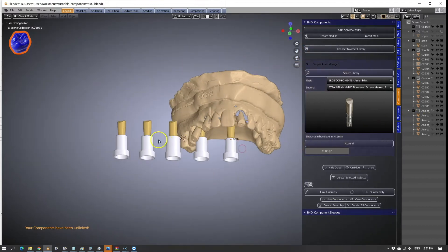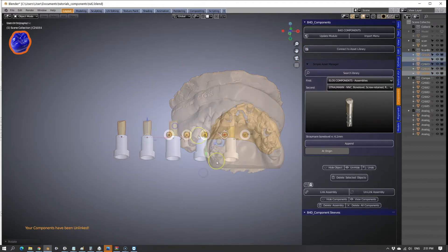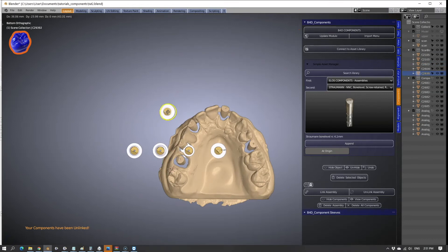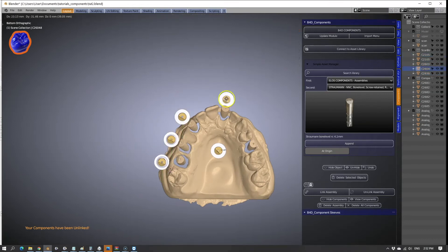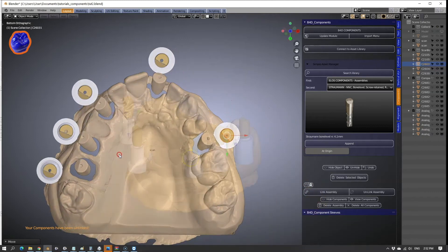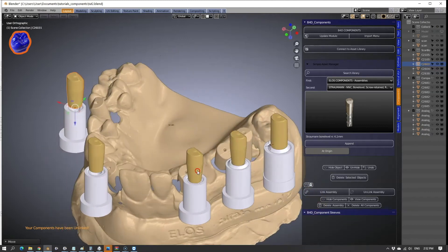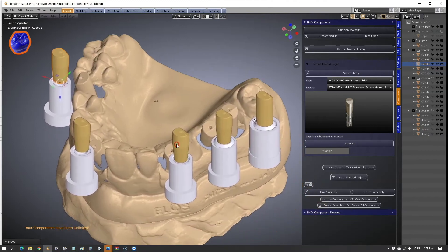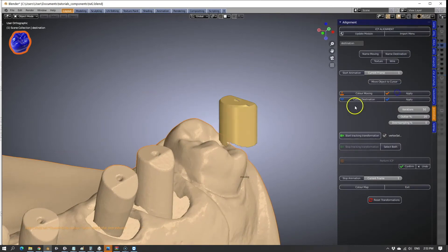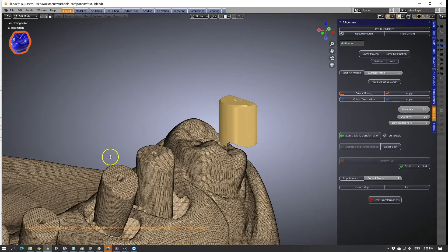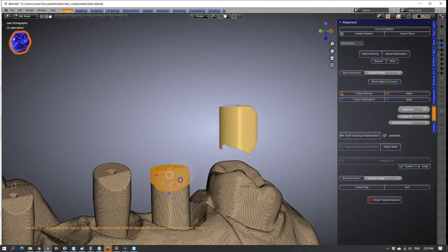All implant analogs include their own analog sleeves to achieve the best possible fit of the analog into the 3D-printed model. The ICP alignment tool is used to match the implant scan body to the intraoral scan.